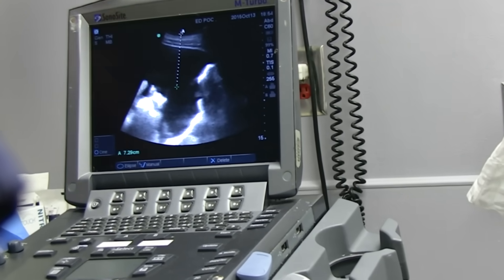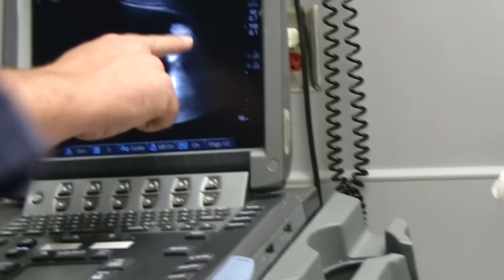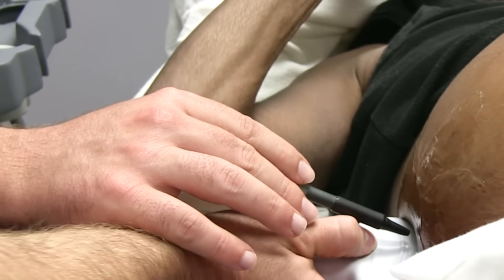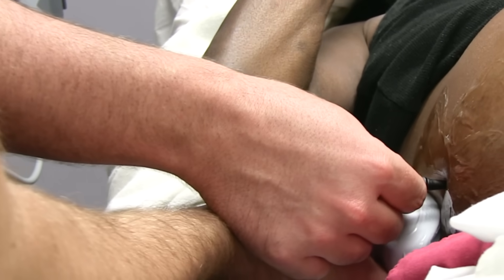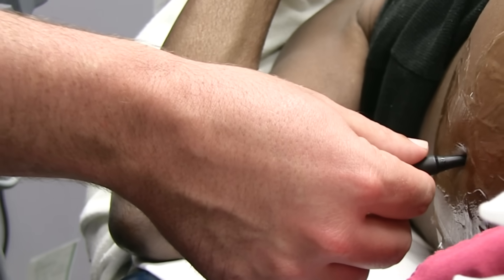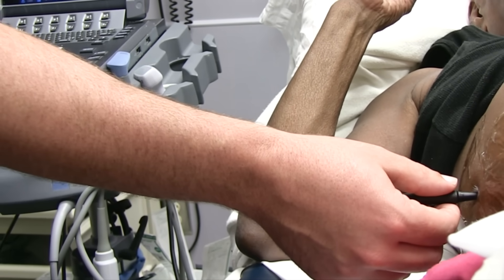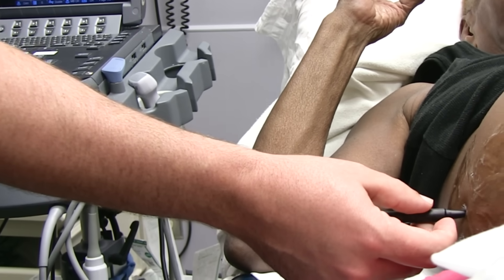Hold that spot, slide up just a bit — I want to stay away from this area. We're really going to go in about right here. Slide a little bit posterior. I'm marking it with the pen — we haven't sterilized it yet. You can take the probe off; that's the spot. I'm making an indentation in the skin using the circular portion of the pen cap, not the ballpoint tip.